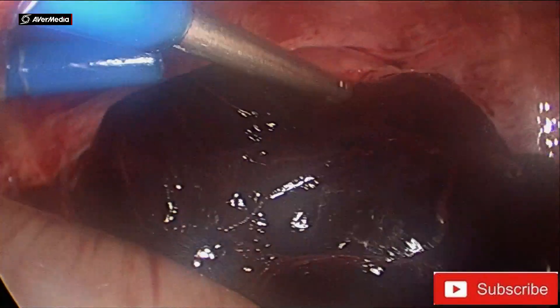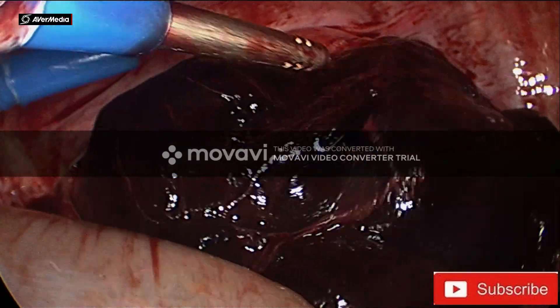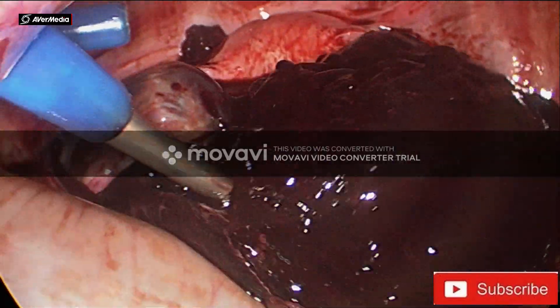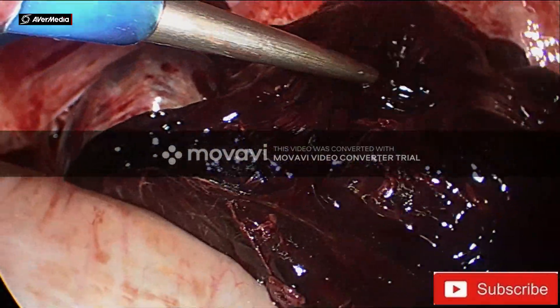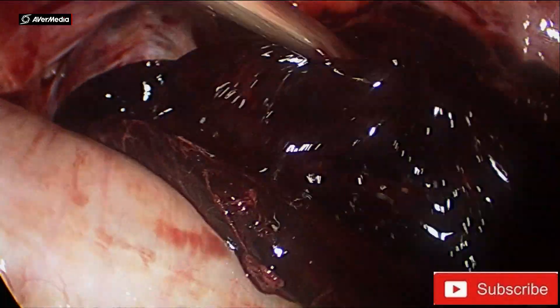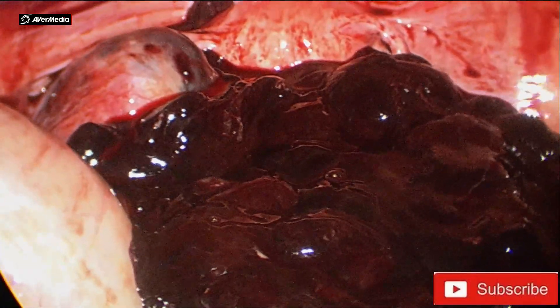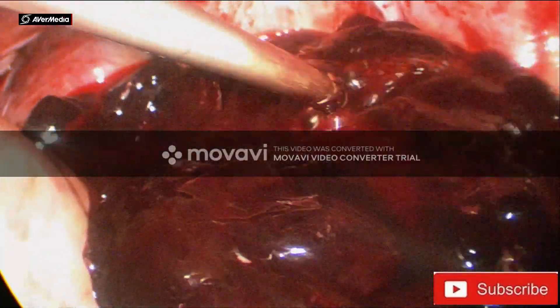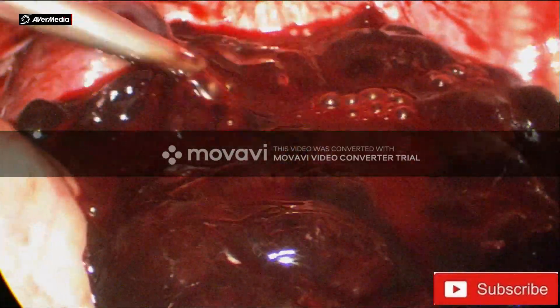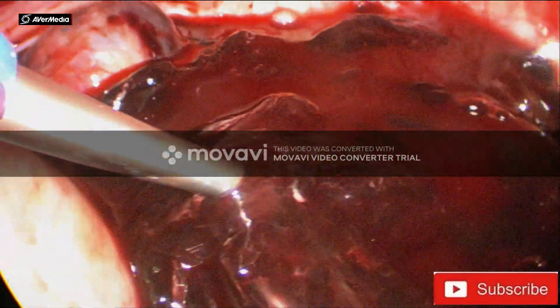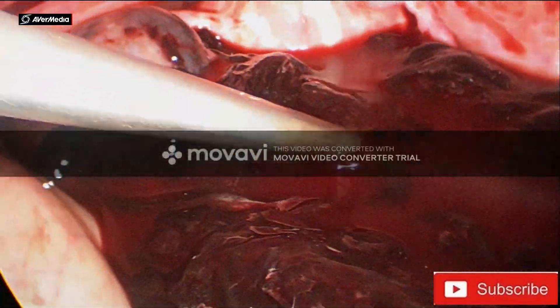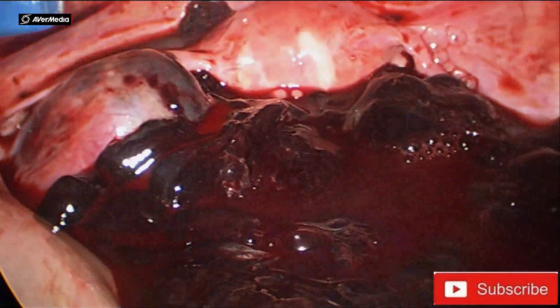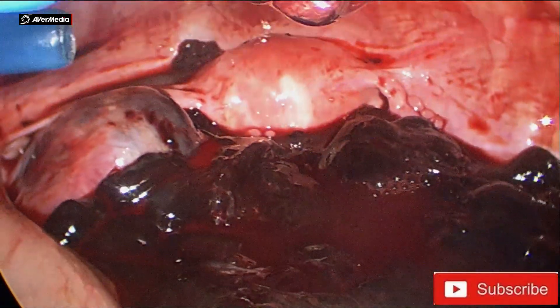We have entered the abdomen and you can see a very large clot — it is almost about 2 liters of blood. We have used heparin to dissolve the clot; we diluted 1 lakh units in 100 ml and after that we irrigated this heparin in the abdomen to dissolve the clot.